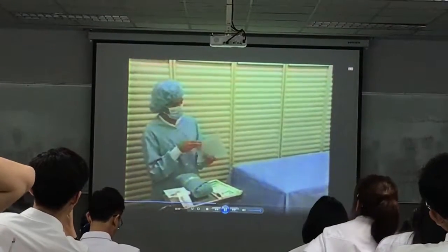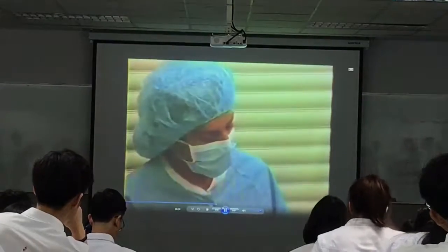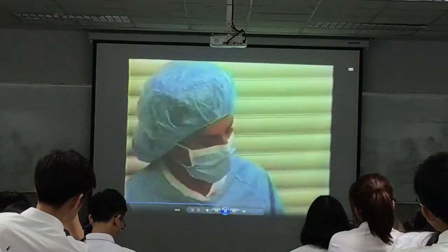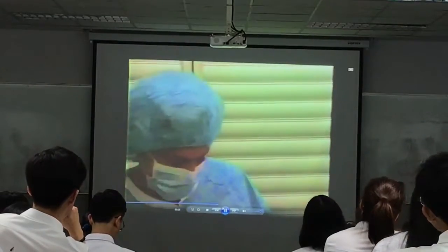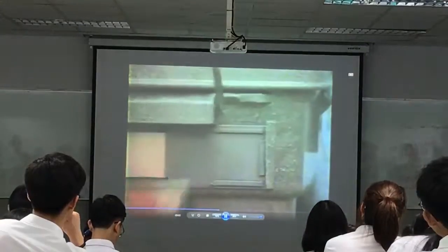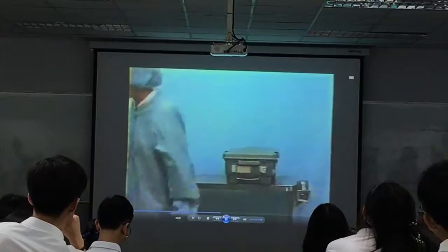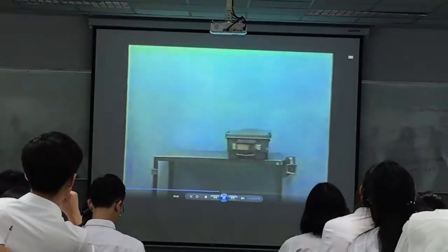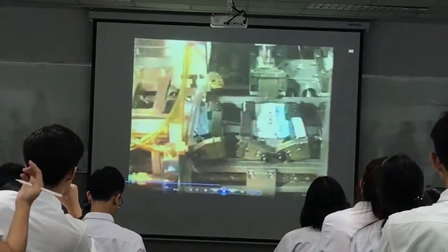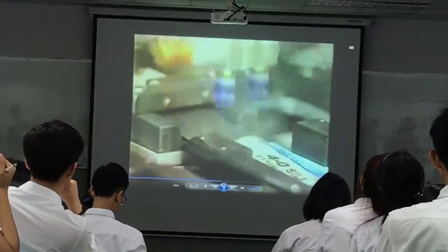Each sterile package must be inspected for integrity before being opened to ensure that its contents have not been compromised by holes, punctures, rips, or moisture. To comply with external regulations, an expiration date is marked on all internally processed materials. Some commercially packaged materials may be marked with either a date of manufacture or sterilization expiration.